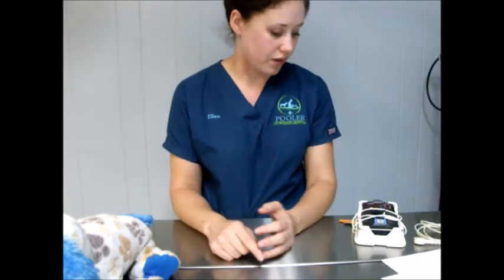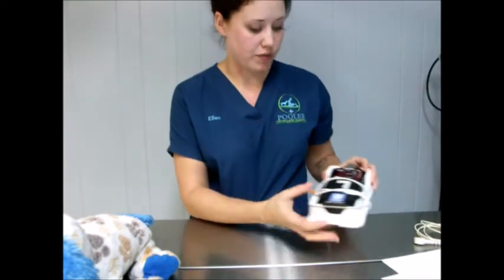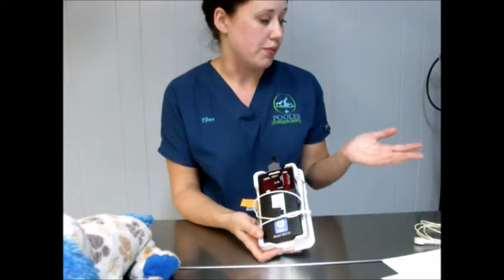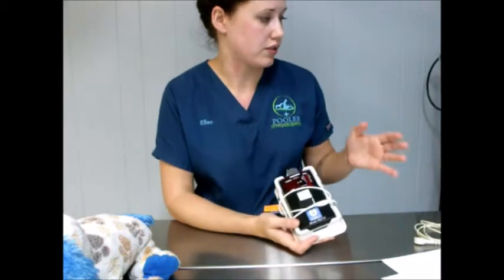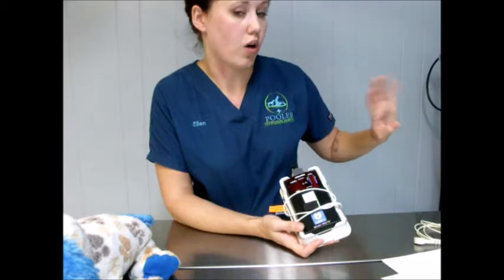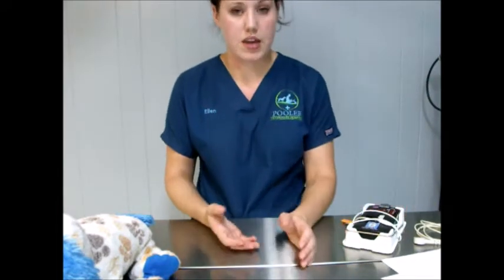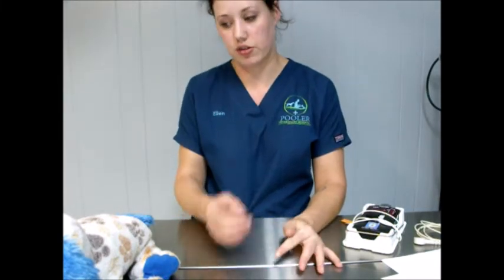Respiratory rhythm, same thing. The biggest thing with that is listening out. Our capnograph lets us know what the respiration rate is and tells us when there are no breaths. But of course, the biggest thing is watching the patient and making sure that you're seeing their thorax and chest walls move, and watching the reservoir bag and the valves to make sure they're inspiring and expiring. Same thing as respiratory rate, that's going to let you know that they're taking in an adequate amount of oxygen.